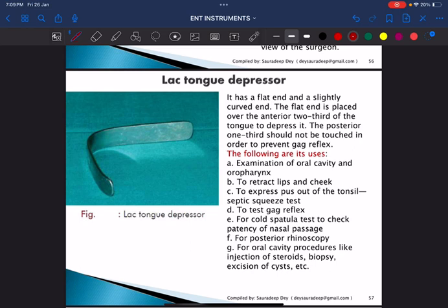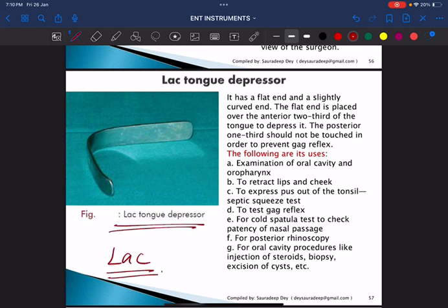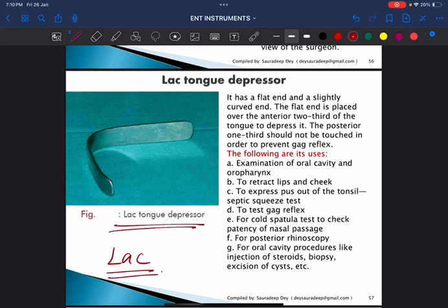This is the tongue depressor. If the examiner asks for the name, it is the Lack tongue depressor.